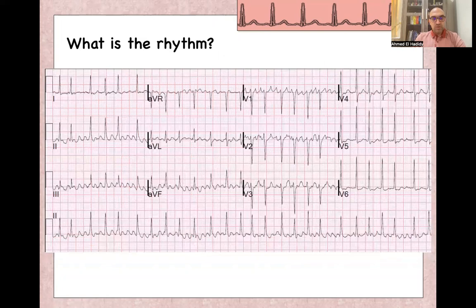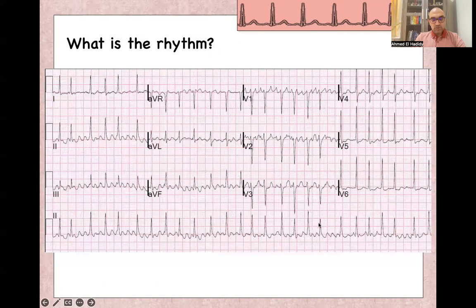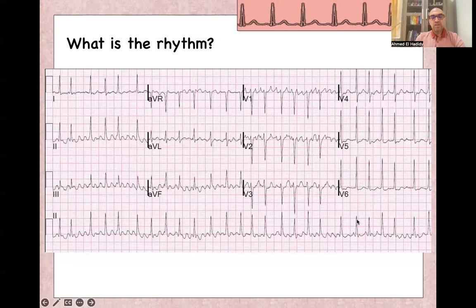In this ECG, at first look it may appear like atrial flutter. But if you look deeper, you will find different morphologies for these waves, along with some very short R-R intervals. This is actually atrial fibrillation, not atrial flutter. The very small R-R intervals are only possible in atrial fibrillation.